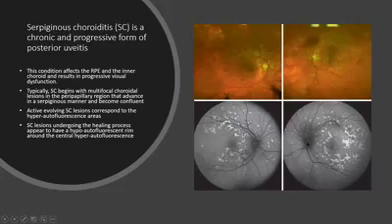So if I want to take a decision on this patient, whether to treat him or not, and I was unable to do the fluorescein angiography for him, I can go for the fundus autofluorescence, a non-invasive imaging modality, and I can differentiate whether these lesions are active or not active, and I take the decision for the treatment.